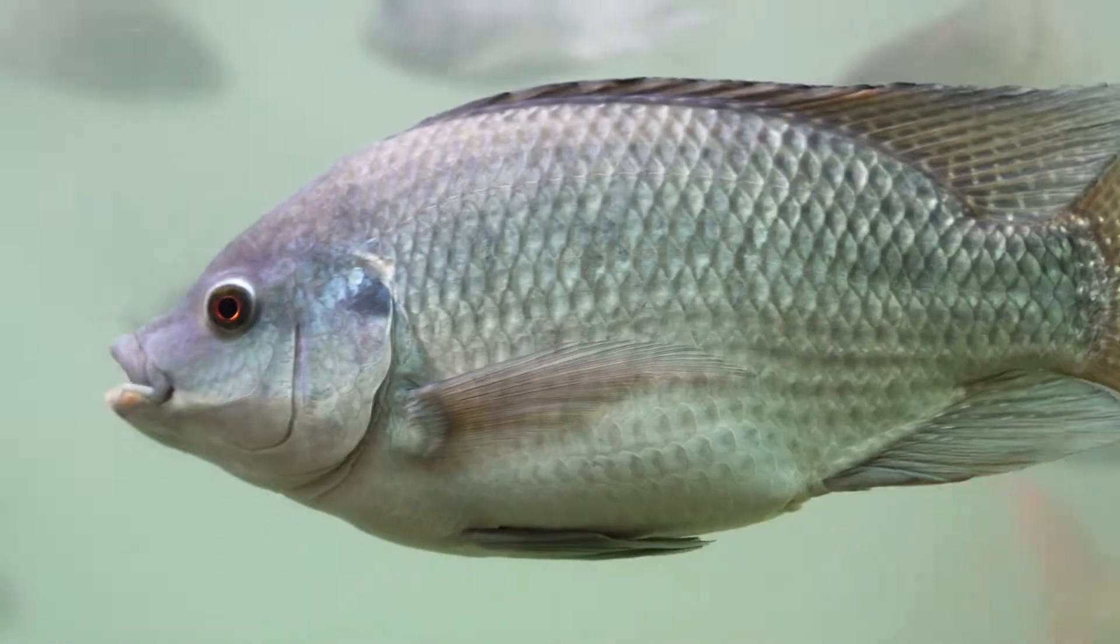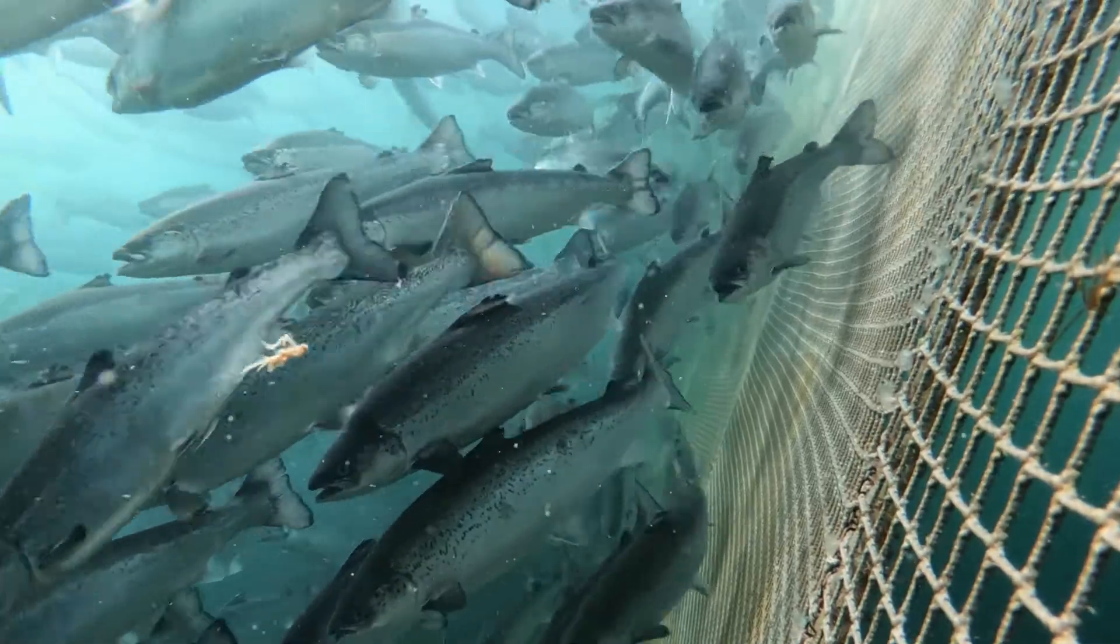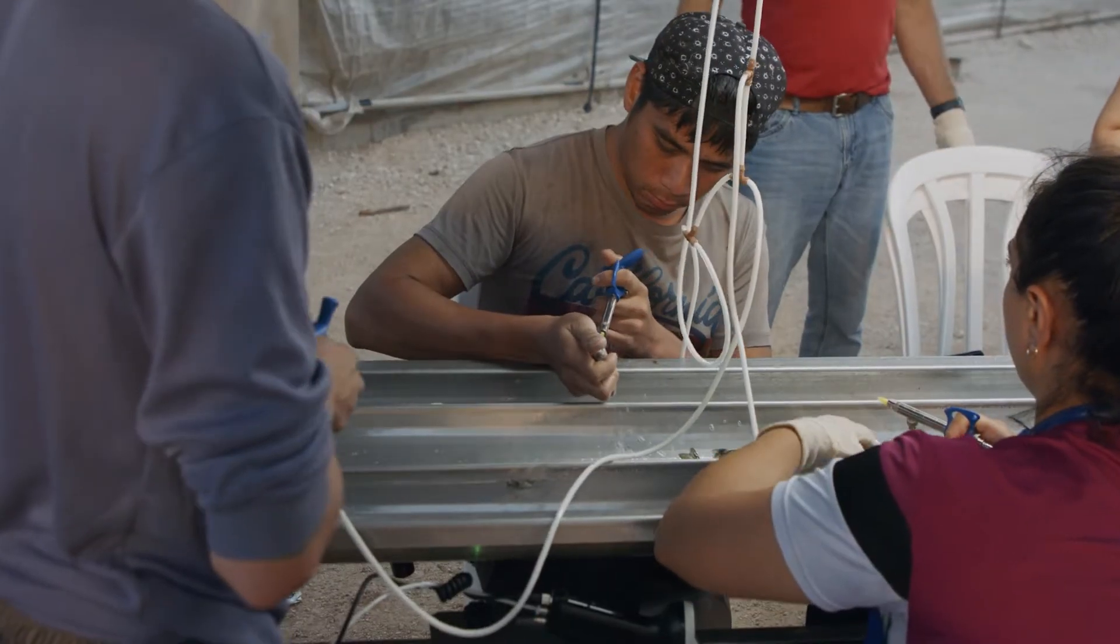We all know the saying, there are a lot of fish in the sea. And getting them vaccinated quickly and effectively is a global challenge.